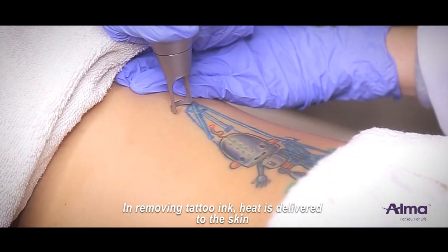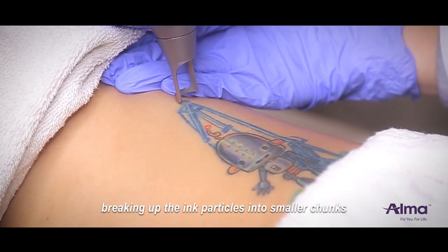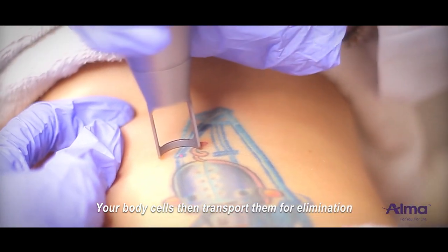In removing tattoo ink, heat is delivered into the skin, breaking up the ink particles into smaller chunks. Your body cells then transport them for elimination.